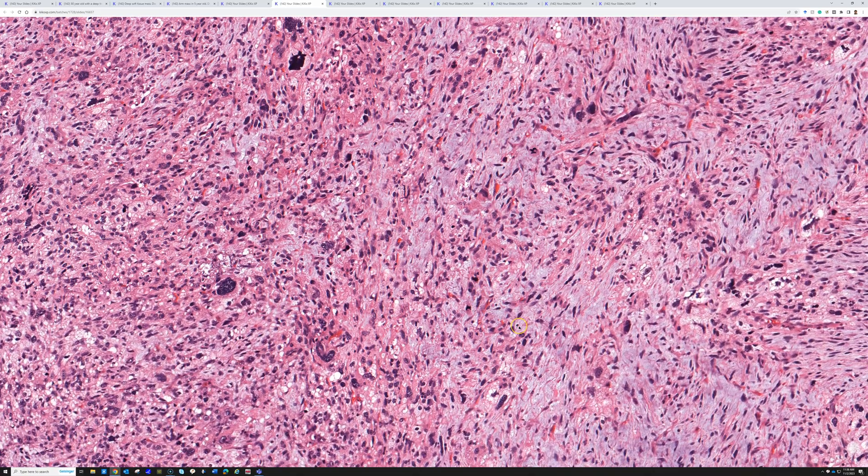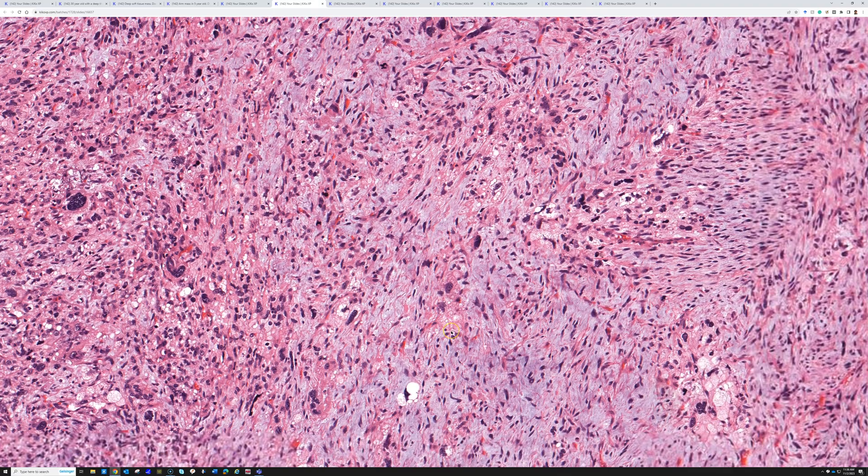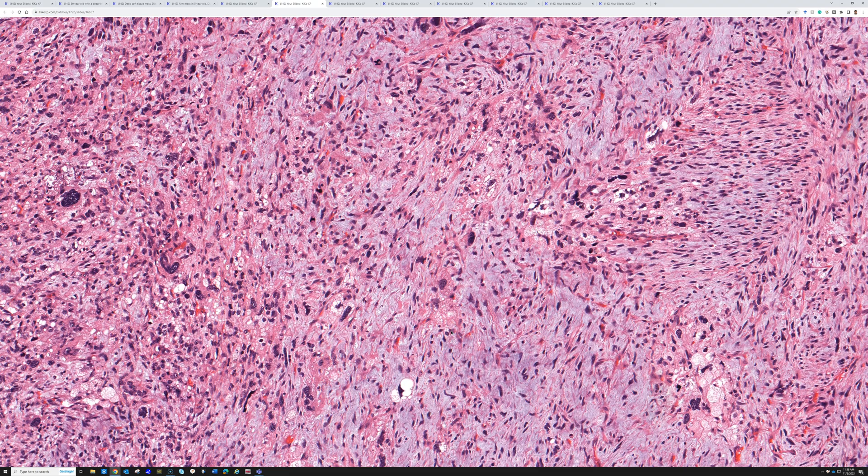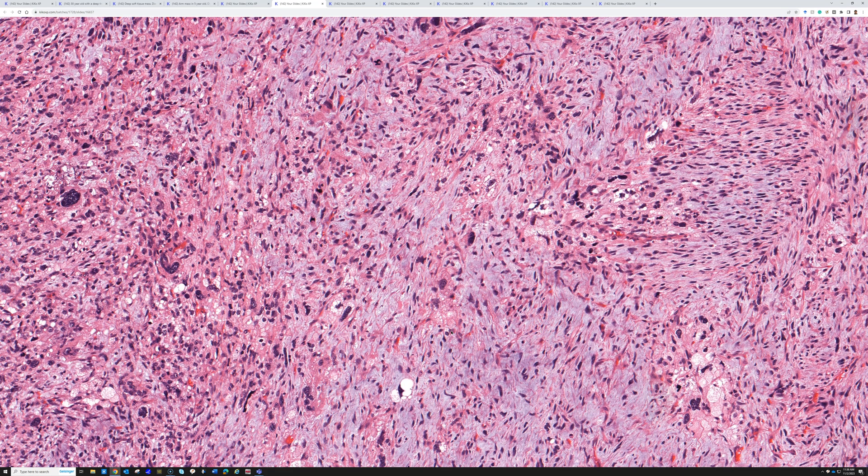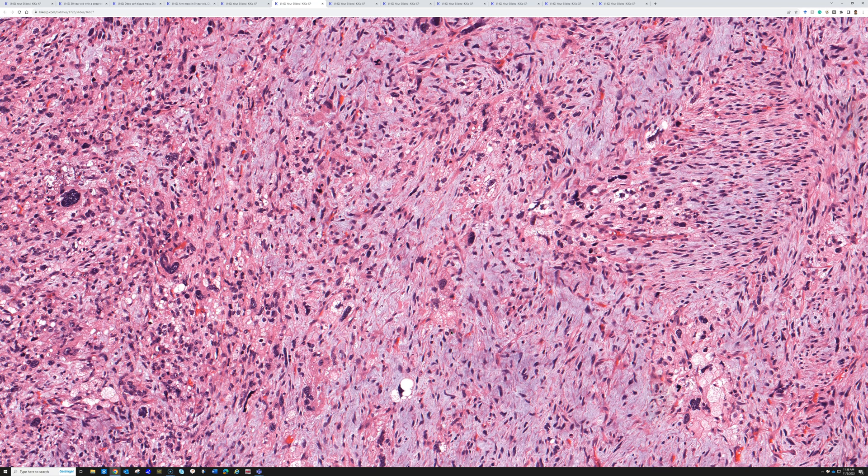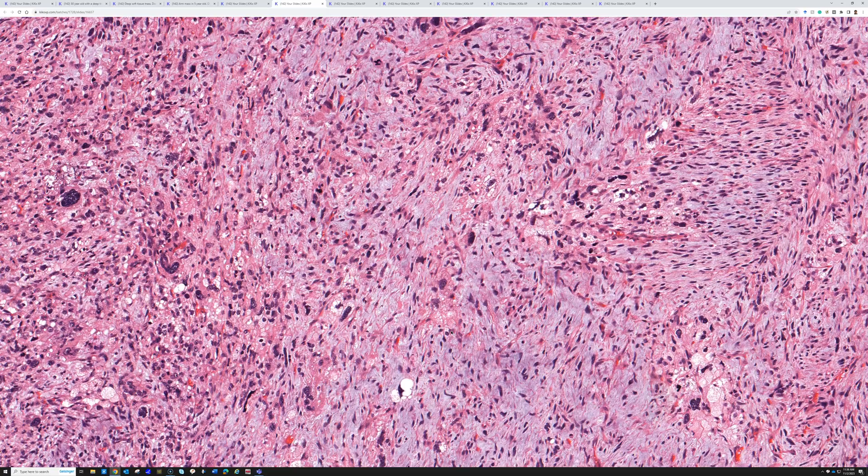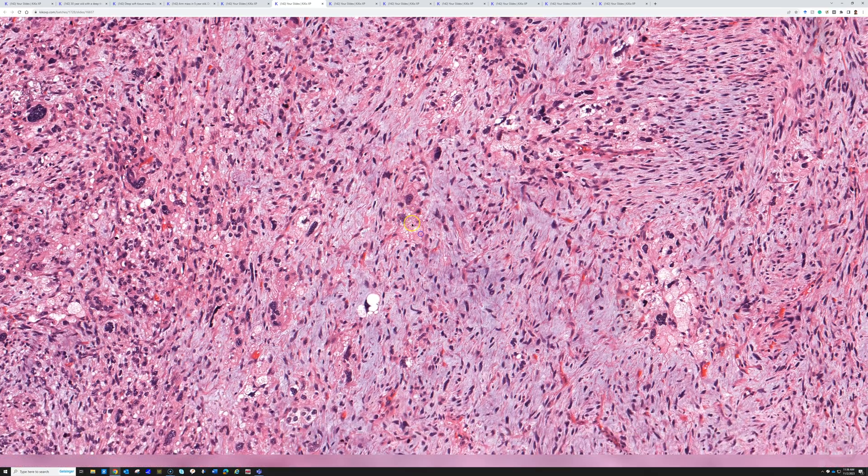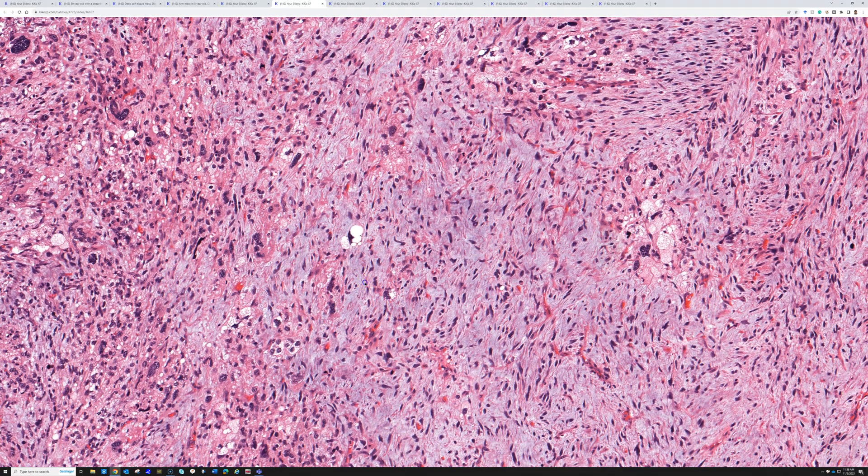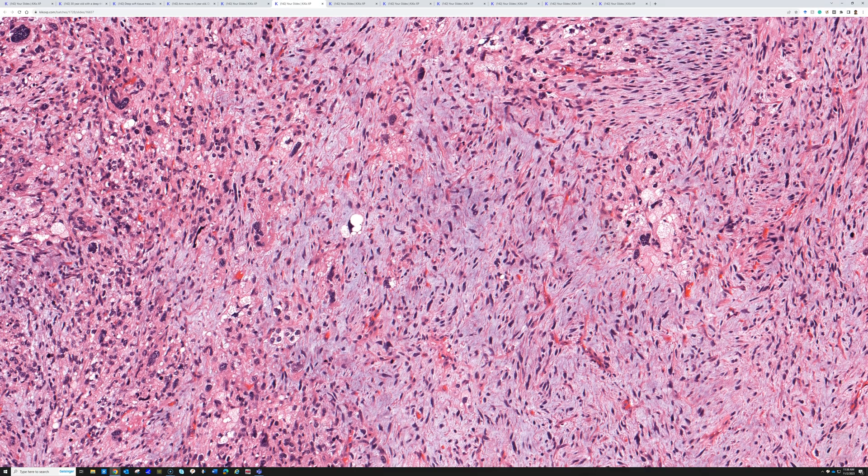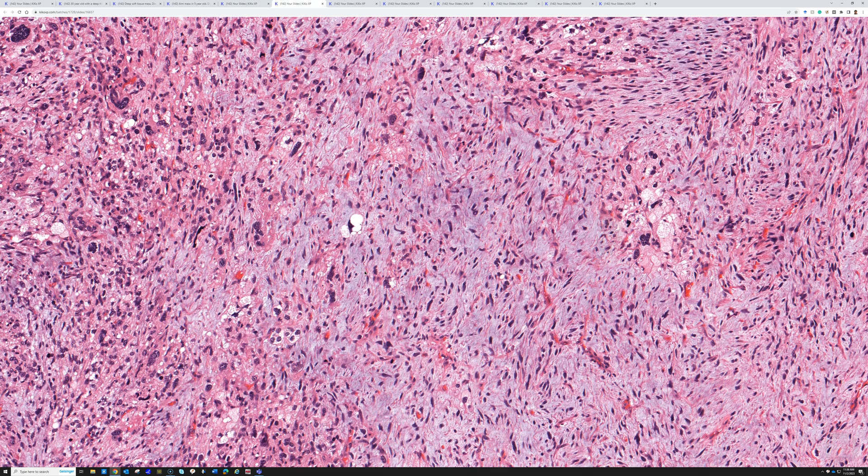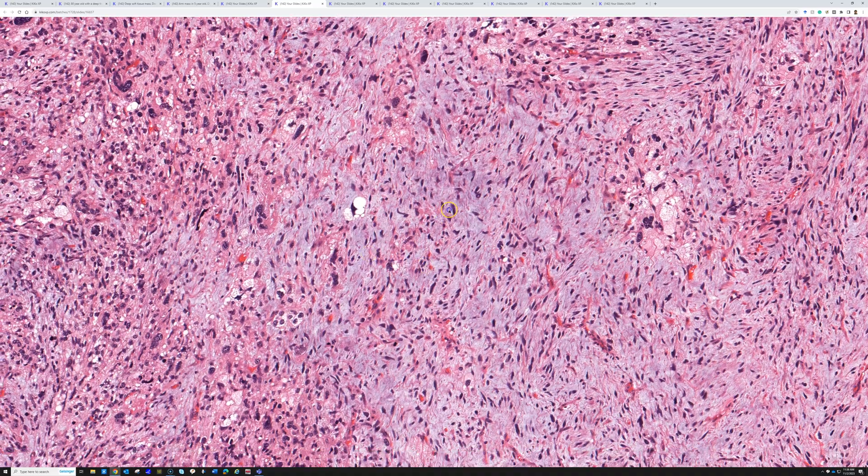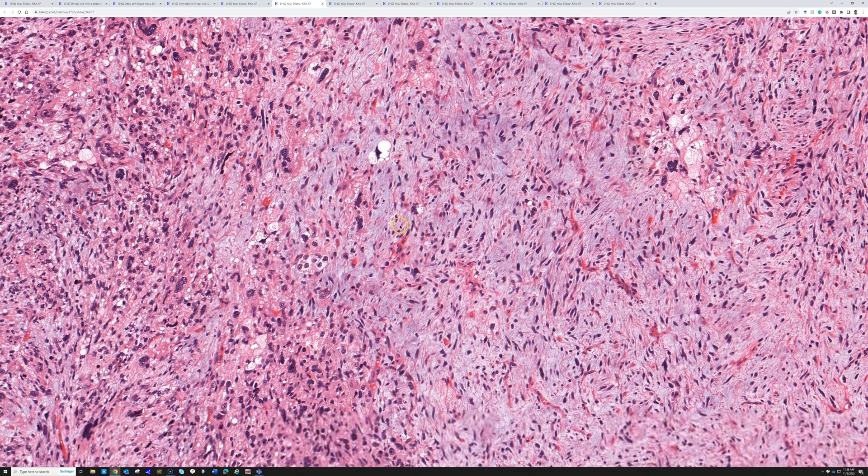This is a good reminder that any form of liposarcoma can have myxoid background, not just myxoid liposarcoma. You can have myxoid background in de-differentiated liposarcoma, in well-differentiated liposarcoma, and in pleomorphic liposarcoma. The presence of blue myxoid change in a liposarcoma does not prove what type it is. I've got a whole long video about liposarcomas on my YouTube channel, and it even has Spanish translation subtitles.